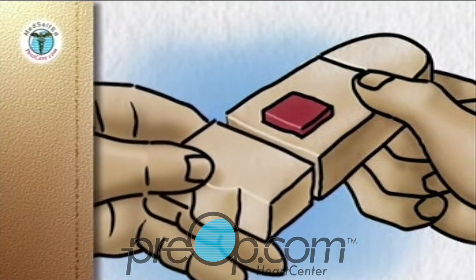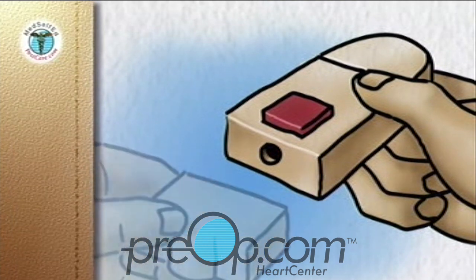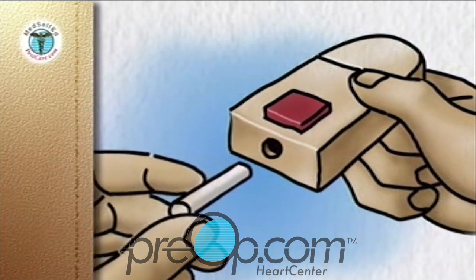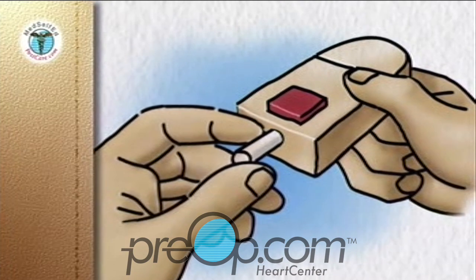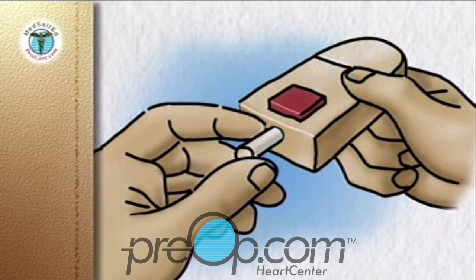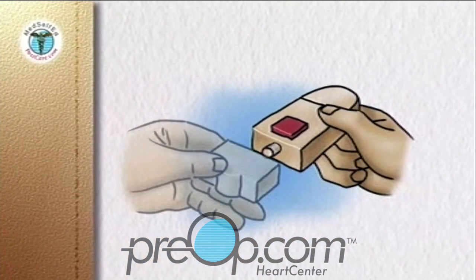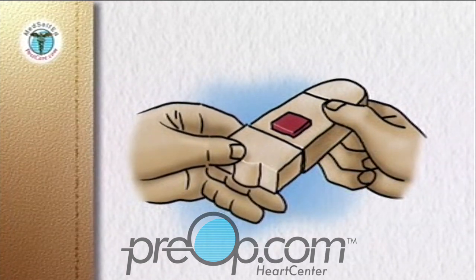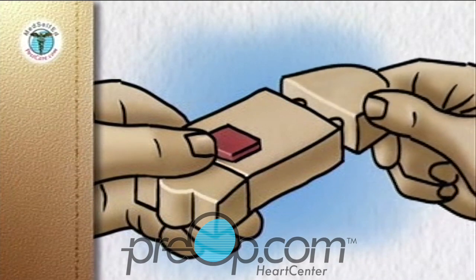Remove the end cap from the lancing device. Insert a short lancet into the lancet holder, according to the manufacturer's instructions. Twist off the protective cap and save it for the disposal of the used lancet. Replace the end cap. The depth of the puncture depends on the end cap used. Recock the lancing device.